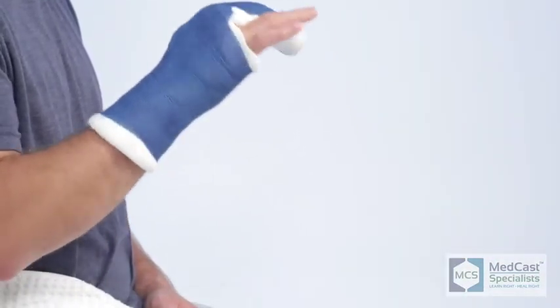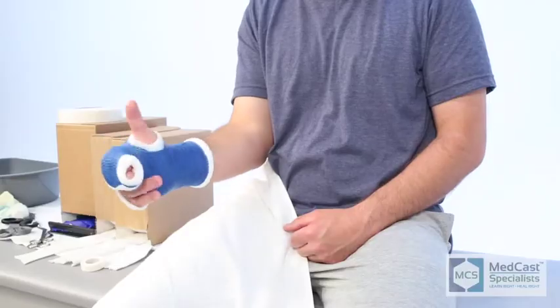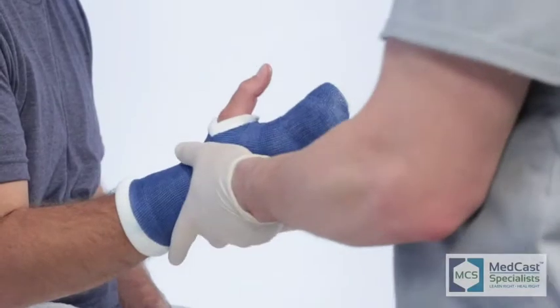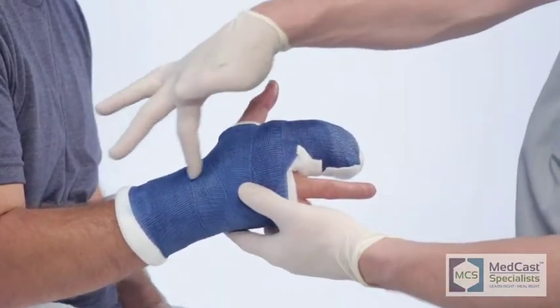On radial gutter casts, there's going to be times where you may be asked to include the second, third, and fourth. And like Clint mentioned earlier in the video, if you're asked to do a radial gutter cast to include the 2, 3, and 4, you know it's on the radial side of the wrist. That's why it's called a radial gutter cast.